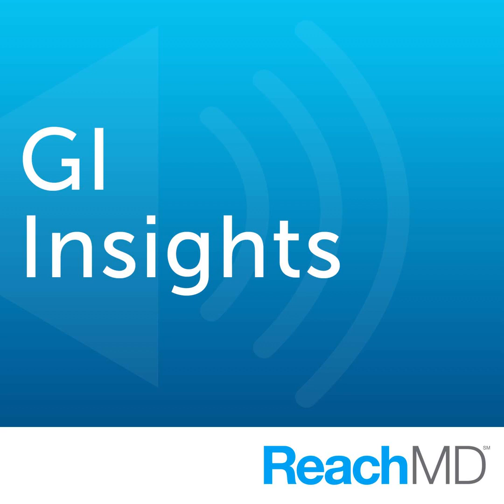But in terms of even diagnosing complications of IBD, like an abscess or a fistula, as you gain experience in performing intestinal ultrasound, you can find these with high degrees of sensitivity and obtain quite a bit of information. We're trying to teach our colorectal surgeons to be comfortable with the ultrasound findings before they do surgery. When we know what we're looking at, we're teaching them that what we see can be as good or even better than what we find on the imaging studies that they're used to. But this is a learning curve, as with all new things, and we're trying to get the word out, which is why I'm grateful to you that we're talking about it today.